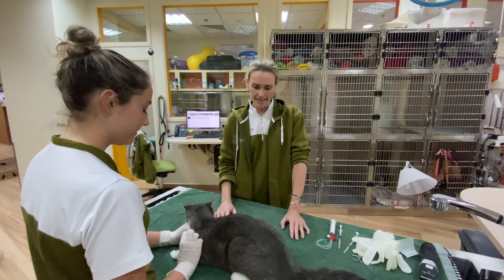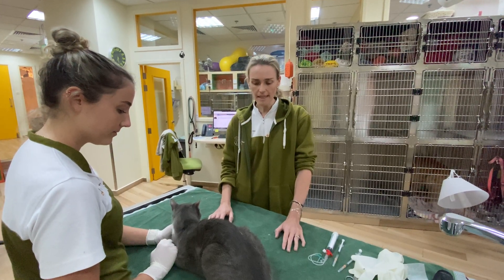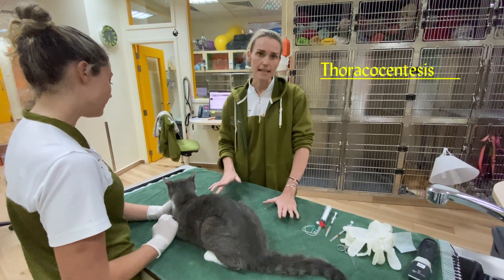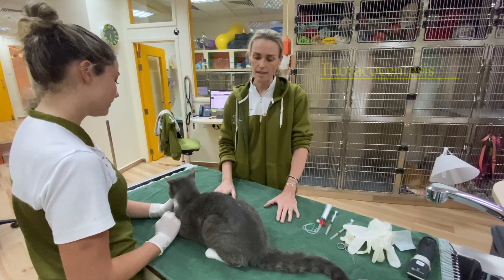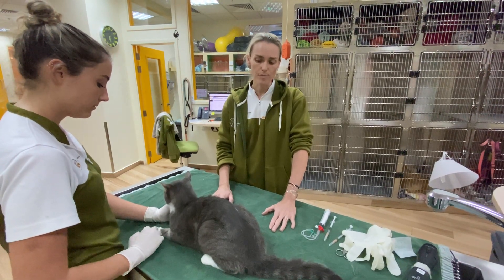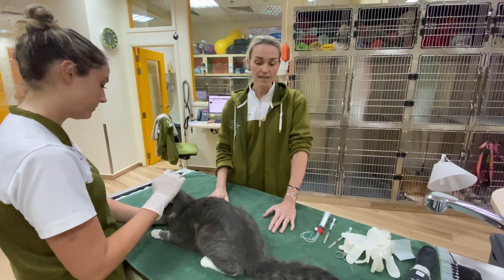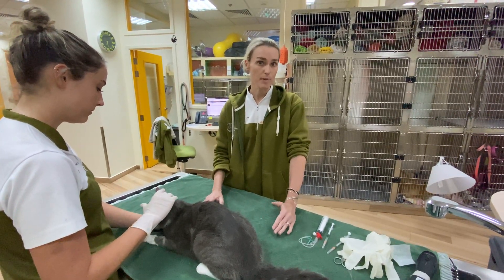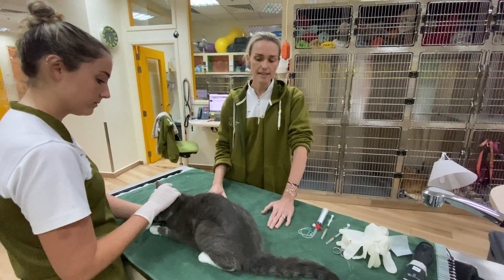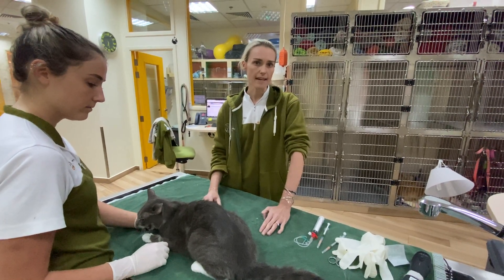Hi everyone, today we want to discuss a procedure that we do called thoracocentesis. It's where we actually stick a needle into the chest cavity, and we do this to remove fluid or air, especially if a patient is in respiratory distress — that is when they are struggling to breathe and the fluid or air is compressing their lungs so they can't breathe properly.